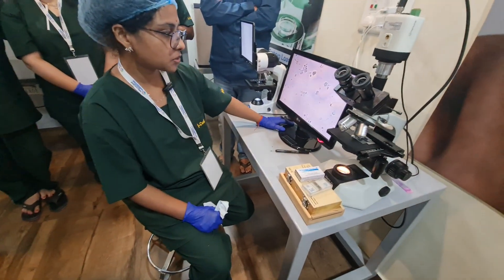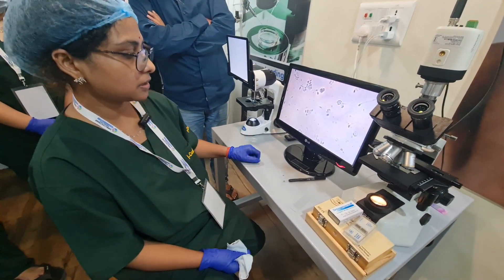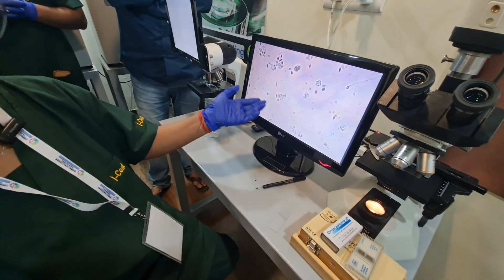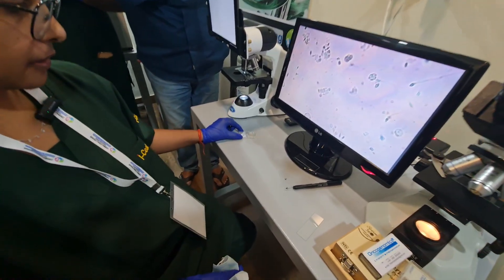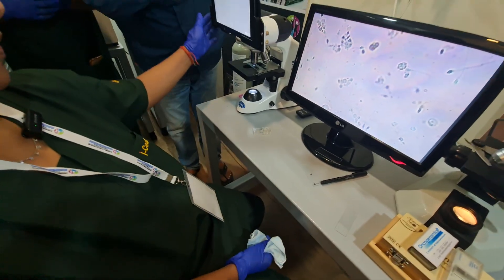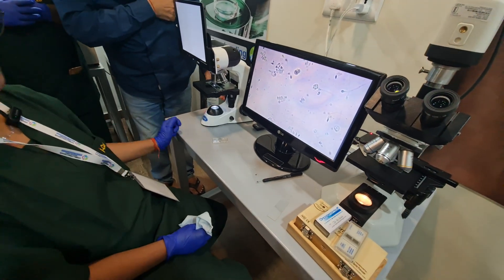Sir has taught us one method of sperm preparation. This is the native sperm sample in which, under the microscope, we are seeing lots of debris and active sperms. But after sperm preparation, which we have done in this sperm separator, this is the view where we have seen that most of the debris has gone and the sperms have capacitated more.